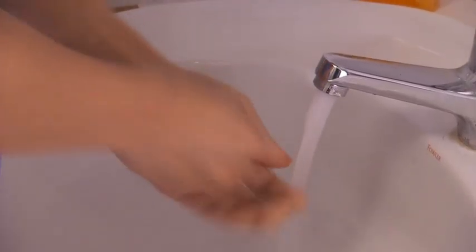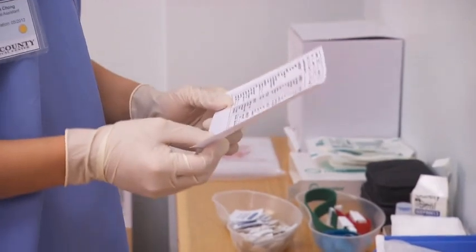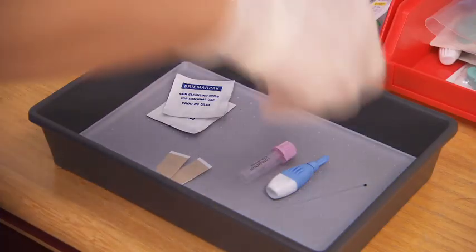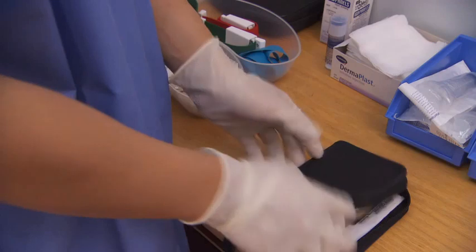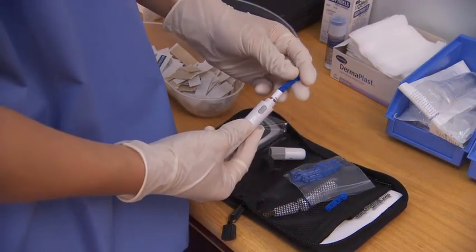First, wash your hands and put on gloves. Review the laboratory requisition form and set up the tray with the appropriate equipment for each procedure. Place the lancet in an automated device as required.